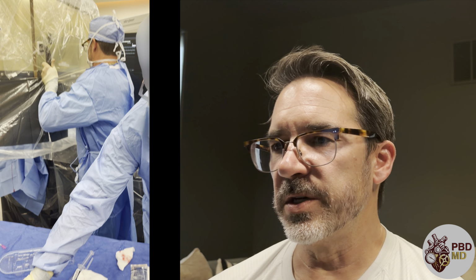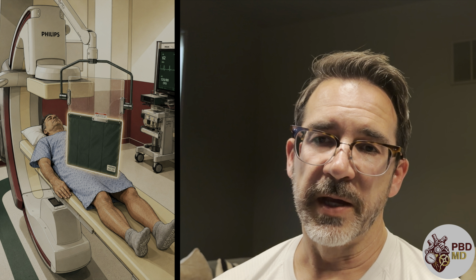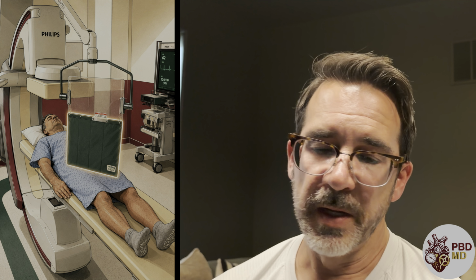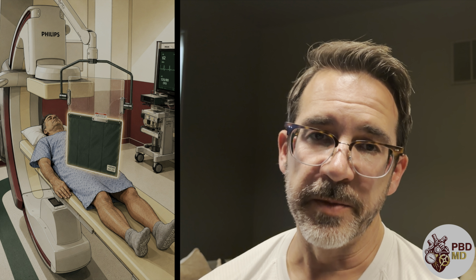Now, in this procedure, we're using what's called a Rampart lead system. In any cath lab, there's going to be some sort of leaded protection because fundamentally we're using x-rays to take the pictures. So we have to protect everybody in the room. Now the patient does get exposed to radiation. That's the consequence of this type of test.